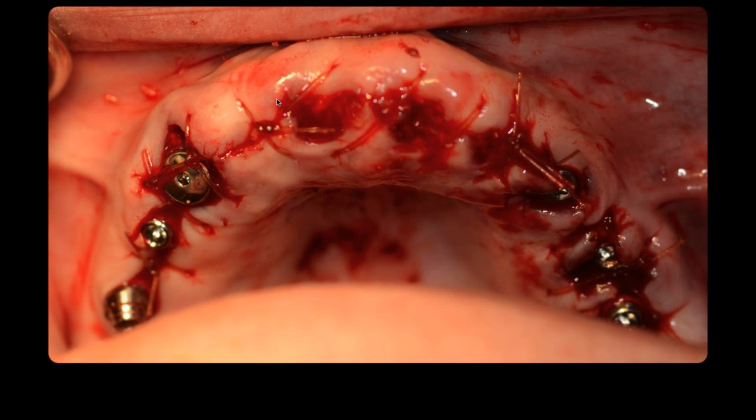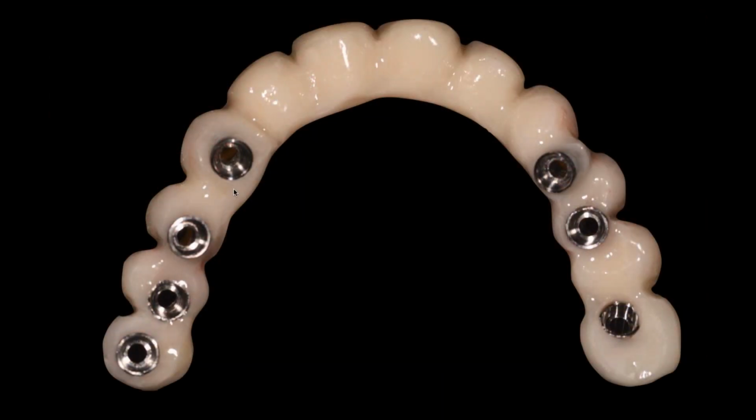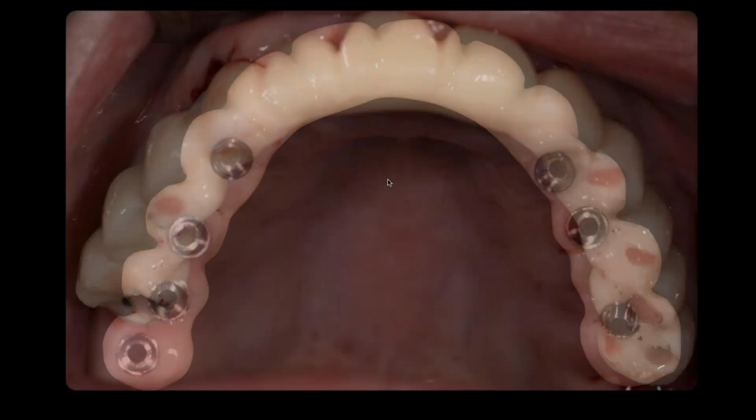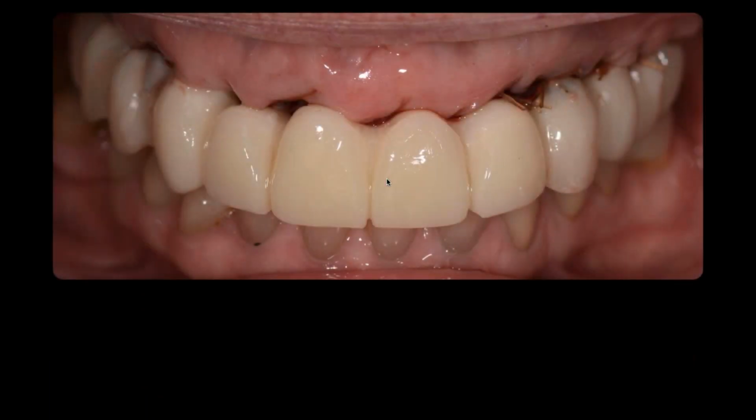I just treat it like extraction sites. It's really easy. So then I get to this point, and then she goes down the hall, and the dentist, who was very good, went ahead and just converted it, picked them up, and trimmed them down, and then screwed them in. So it was pretty quick. We had a bite, we had a registry, so we knew where to go. And here she is after.